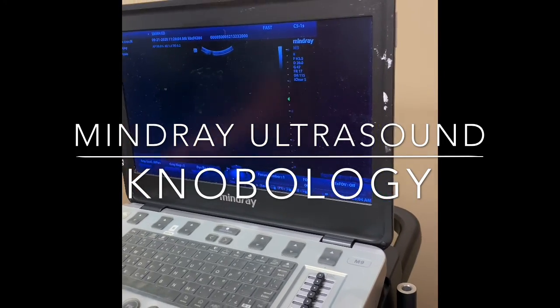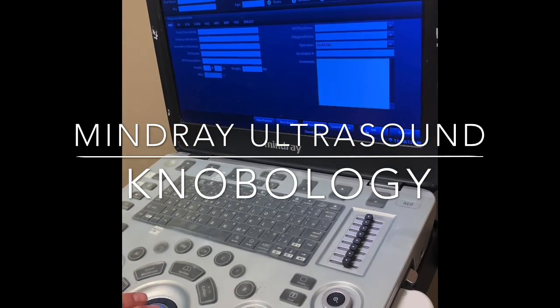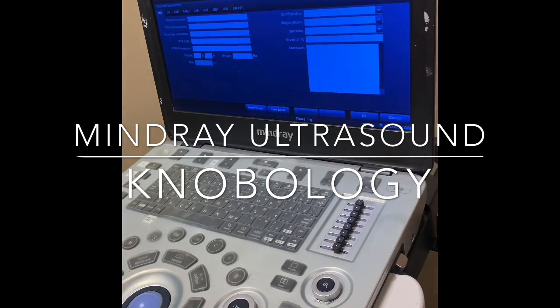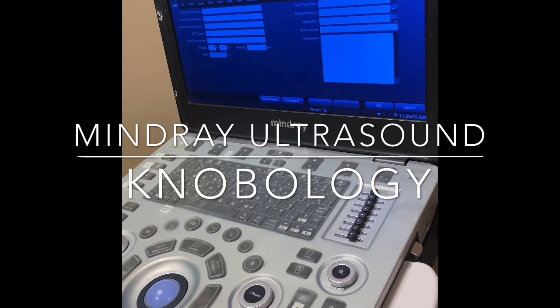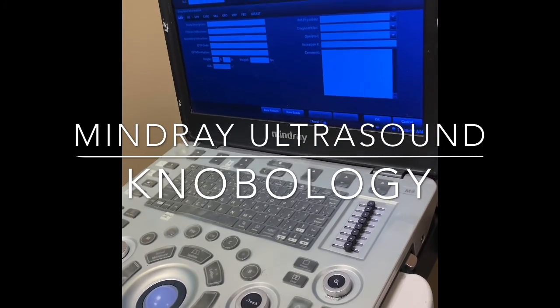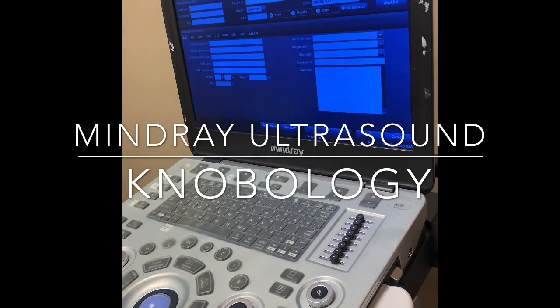If you're unsure, you have the option of going back to the patient screen, and you will see that it is populated here. At this point, you have your images saved already, so you could go ahead and end the exam, and it will upload the images to QPath. If you click End the Exam without saving the patient or provider information, the images will still go into QPath, but under a generic study with no name. This could later be updated within QPath, and we will have a separate QPath tutorial describing that.